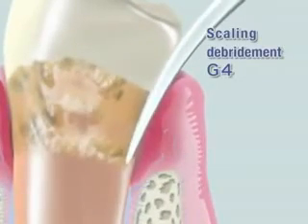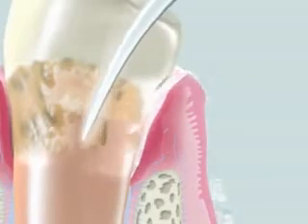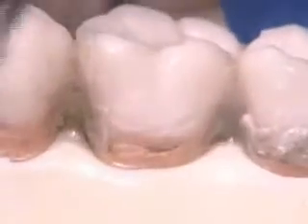Copious irrigation is recommended. Water cooling prevents heat generation of the tip, and irrigation enhances cleaning capability through the cavitation effect.